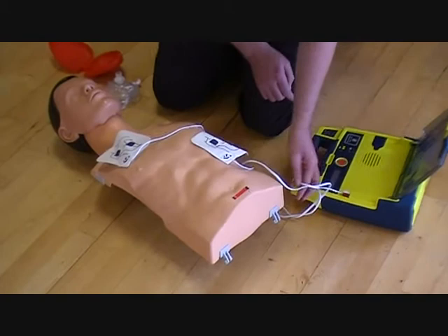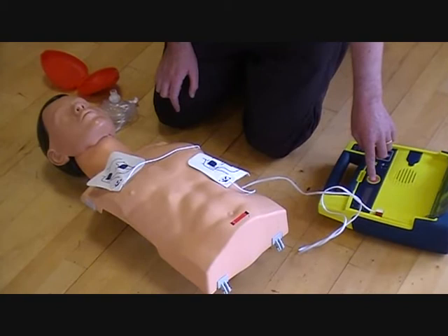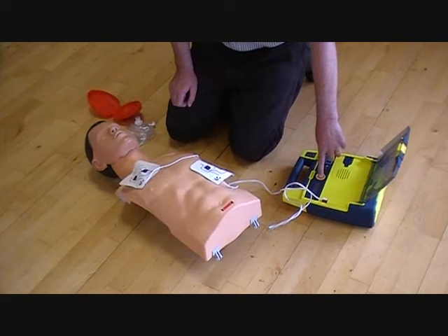Clear, analyzing, put the finger on the button. Look at your patient. Clear, with your right hand, analyzing, put the hand over the patient. Clear. Clear. Clear. Shock advised. Clear. Charging. Machine is now charging for shock. We will now press the shock button to get shock delivered. It is now safe to touch the patient.